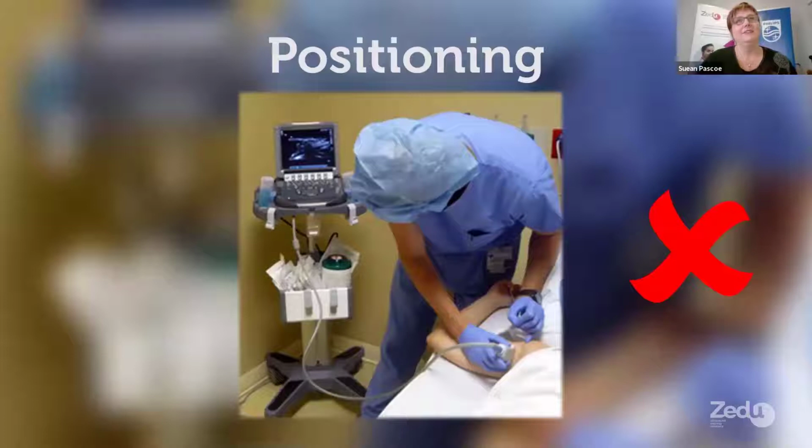And it was interesting because one of the candidates in our course lay down and said, here, do my, I put a cannula in my basilic. And of course I did everything wrong that I'm telling you not to do wrong, and she pointed this out. And then when I did take the time to line up and get the arm out properly and get the machine in the right place, it was rather easy. A bit weird because I'd never done it before, but making sure that everything is positioned well.